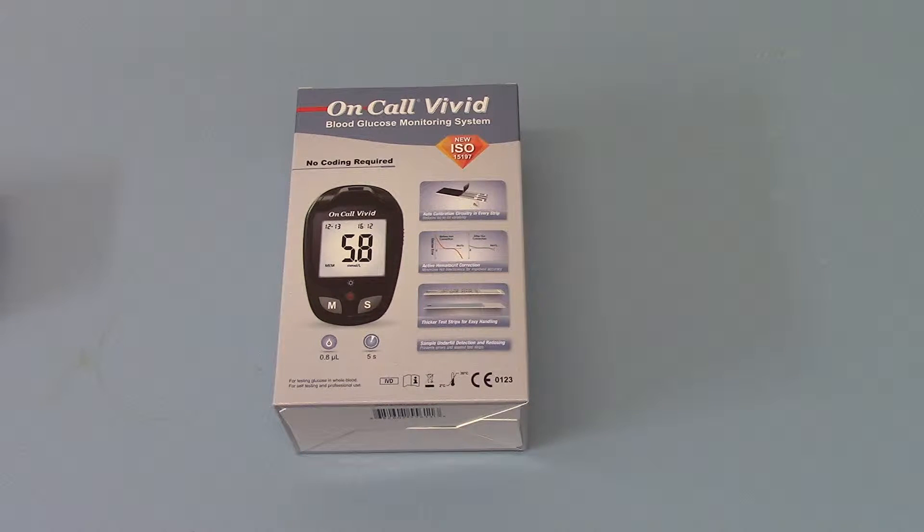The meter gives you readings within five seconds, which is nice and quick — if you're regularly testing you don't want to be waiting 15 to 20 seconds for your result. It requires only a tiny sample of blood when dosing these test strips: 0.8 microlitre, as shown on the packaging.